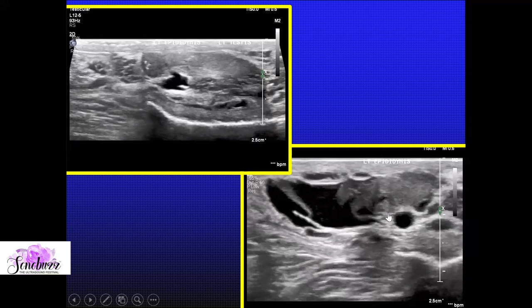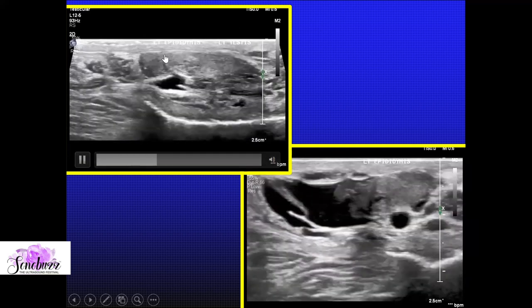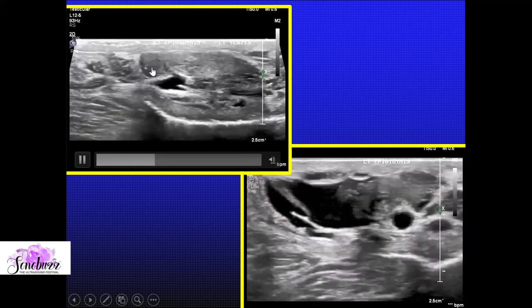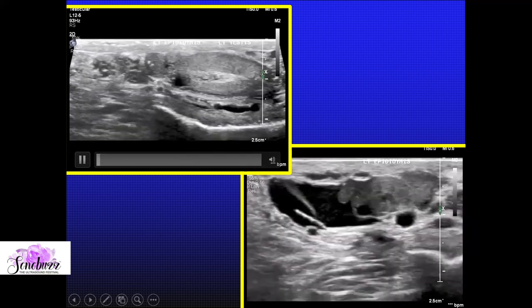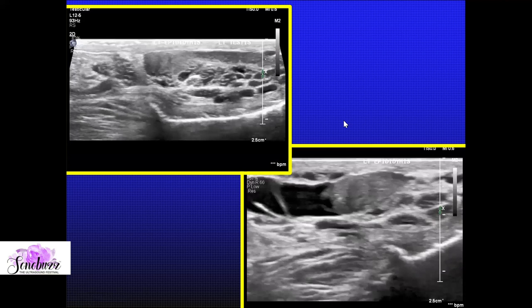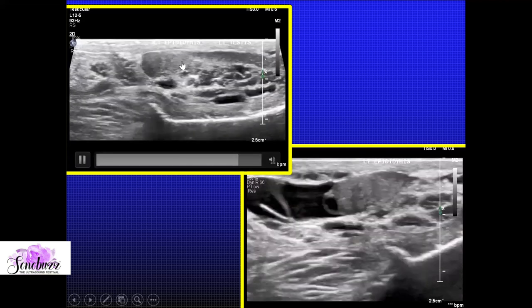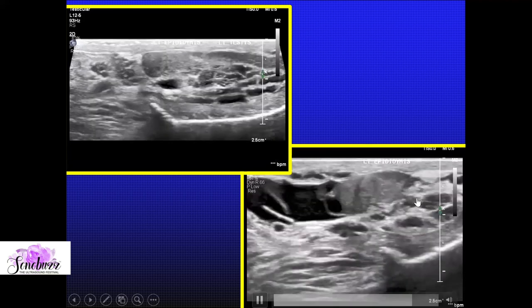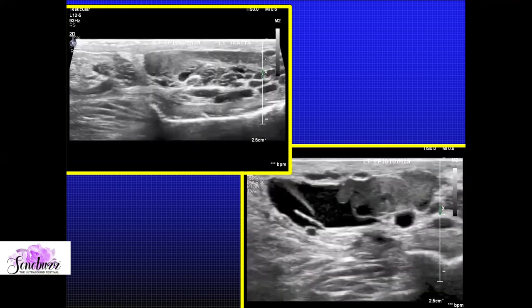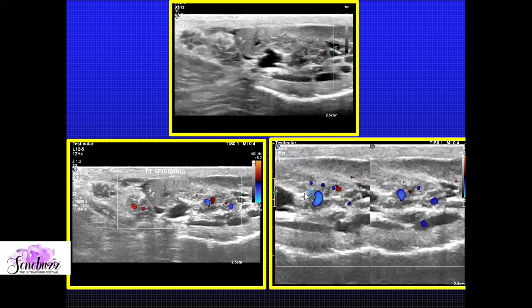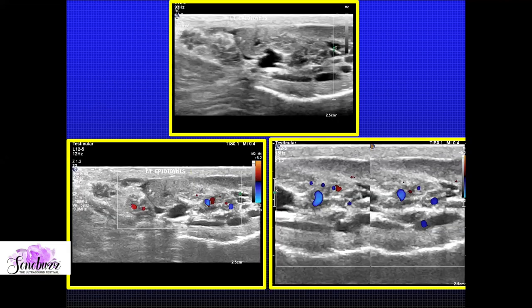Next, image the epididymis. Go to the upper pole of the testes — the structure at the very top is the head of the epididymis. From that point, rotate your transducer 90 degrees and you will see the complete epididymis — its head, body, and tail. Pathologies involving the epididymis, like epididymal cysts or masses, are separate from the testes and can be picked up very confidently this way. Always make it a practice to switch on color Doppler and look at color flow within the testes and epididymis, then extend the study depending on the indication.